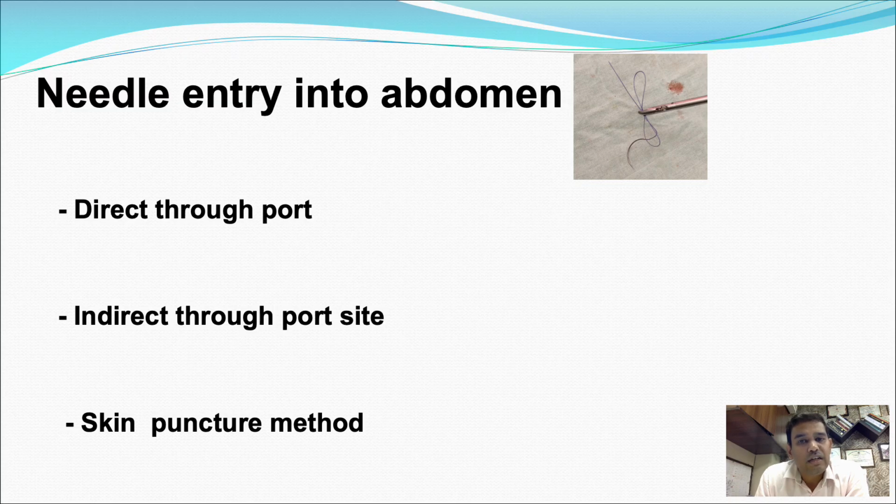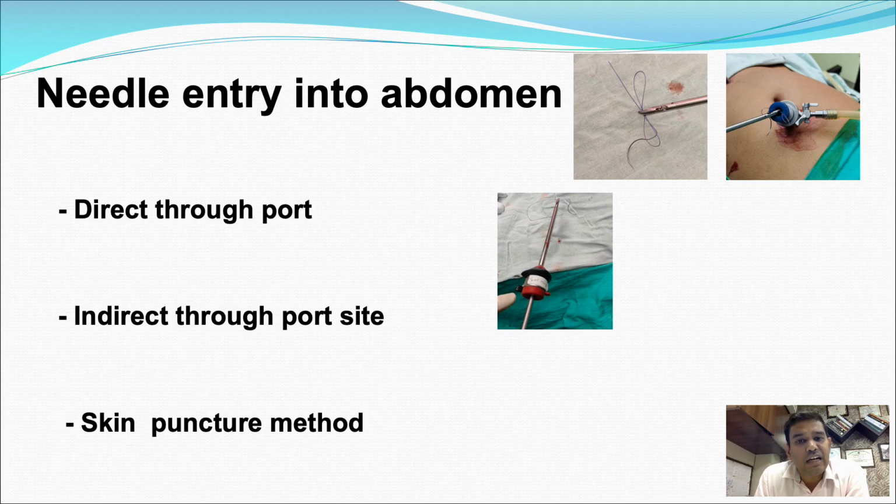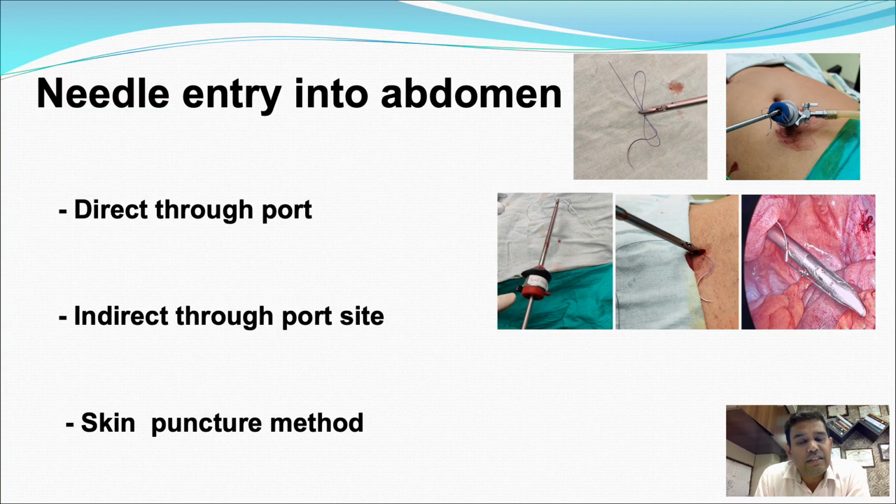You have to hold the suture 2-3 centimeters away from the swage end of the needle, and then place it through the port. Second, the indirect technique, is used when the needle is larger or you're not comfortable passing the suture through the 10 mm port, or you only have 5 mm ports. Then you remove the port, pre-feed your needle holder through the port, and catch the needle about 2 centimeters away from the swage end. Then through the port you have already made, you enter under vision inside the abdomen and insert the needle and the suture.